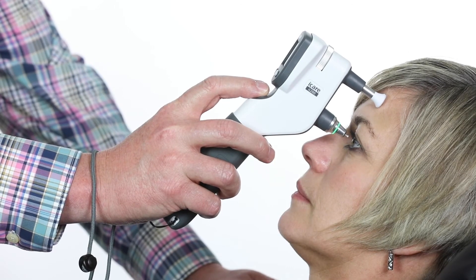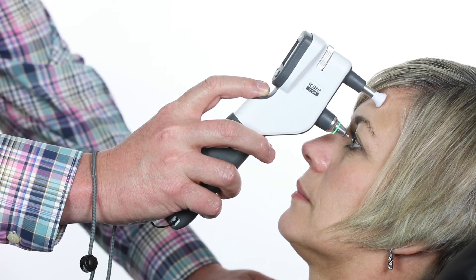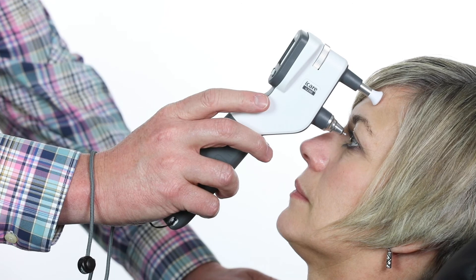When taking measurements on an angle, position patient appropriately, aim the probe in the center of the eye, press and hold the measure button until you hear a long beep.